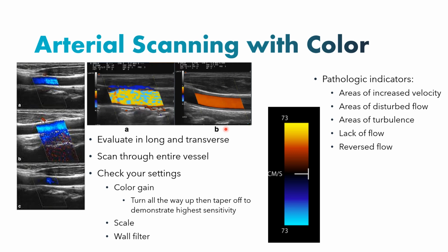If you leave it too high, you're going to get artifact. If you turn it too low, you're going to be missing where blood flow actually exists. So getting it just right, to the sweet spot, is going to be very important. So make sure you find your color gain button and are willing and ready to adjust that.